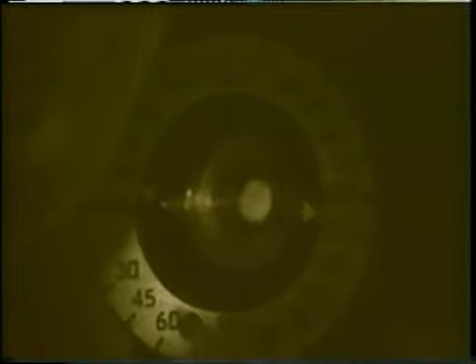There, almost neutralized. Good. I check the other principal meridian quickly, and now I move forward slightly to pick up definite with movement and check the straddle cross for axis refinement, 45 degrees on either side of the cylinder axis. This is the brighter reflex, so I'll move the axis slightly clockwise and check again. These look equal.